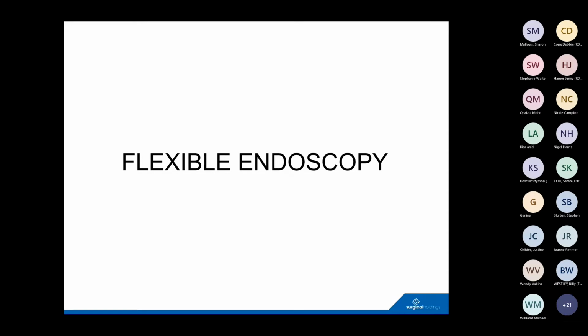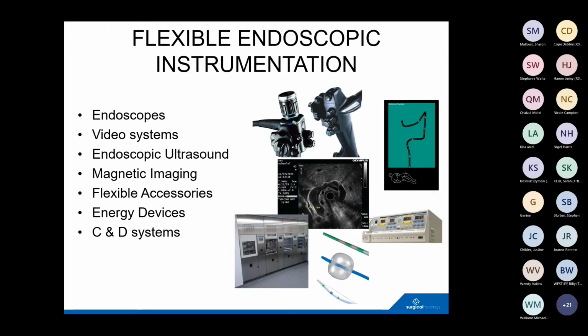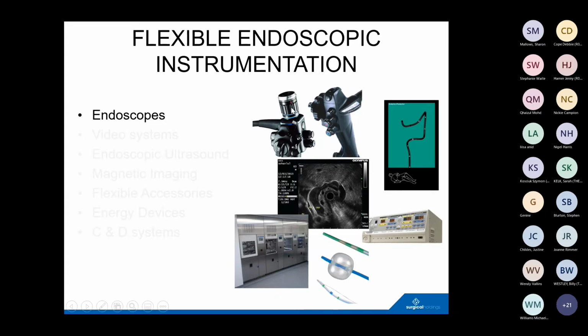We're only going to be looking at flexible, so ignore rigid endoscopy, and principally what we're looking at is the endoscopes themselves, but I did want to highlight that they're part of a system. These are the endoscopes that we're talking about, the flexible endoscopes here, and really that's all we're talking about, but there are other aspects to it.